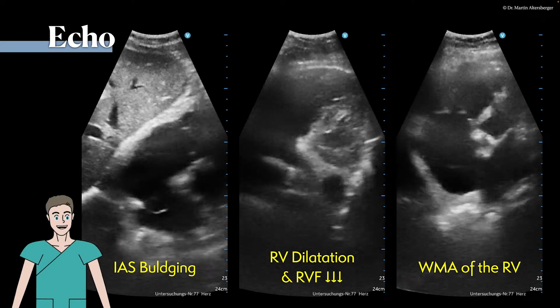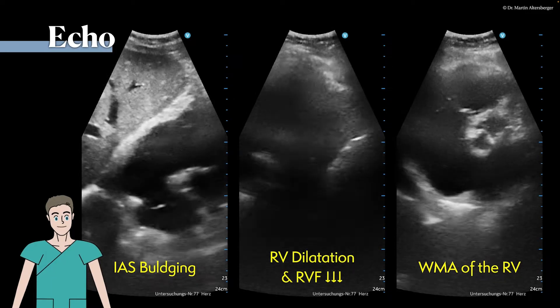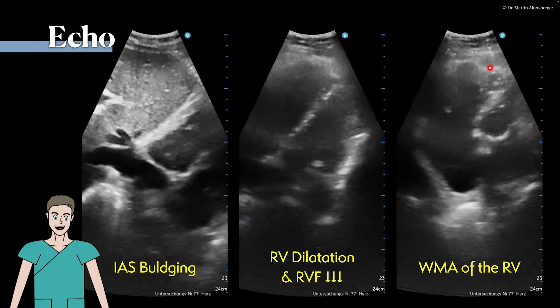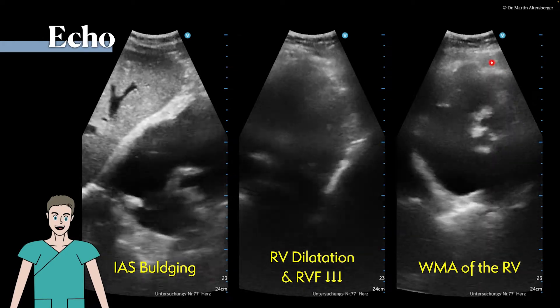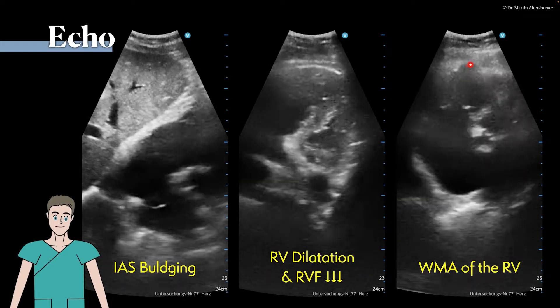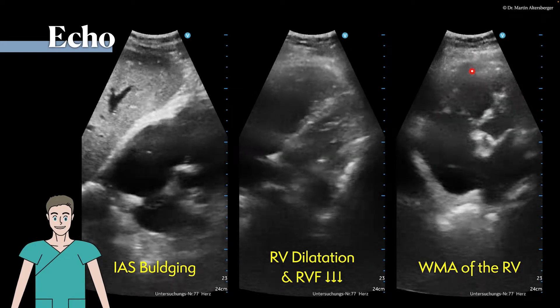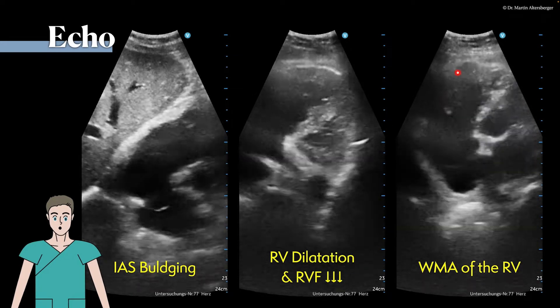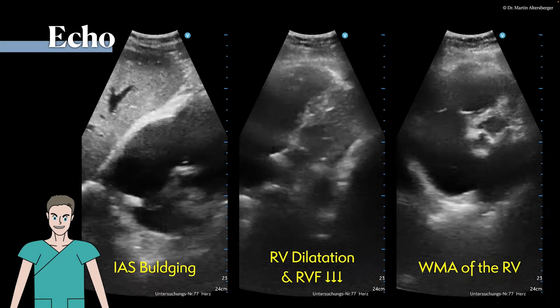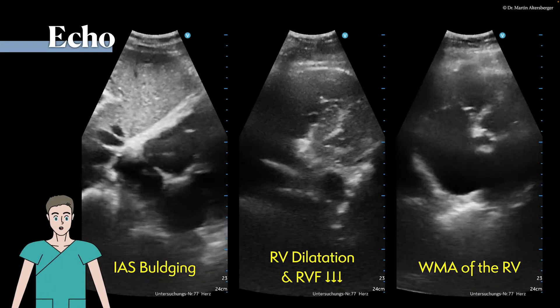Overall he was very hard to scan, as you can see in those images. With several views you get an overview — here again is the apical part of the right ventricle, and here are also parts of the lateral wall. Definitely, even in this atypical view, we can see that right ventricular function is severely impaired, with wall motion abnormalities of the right ventricle.